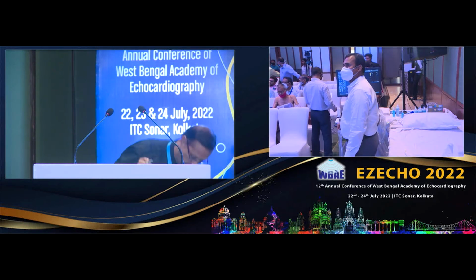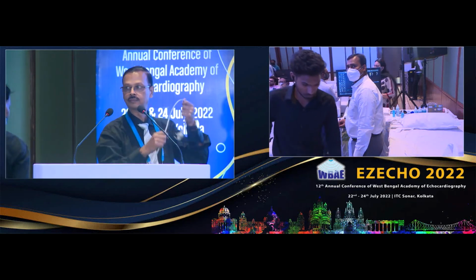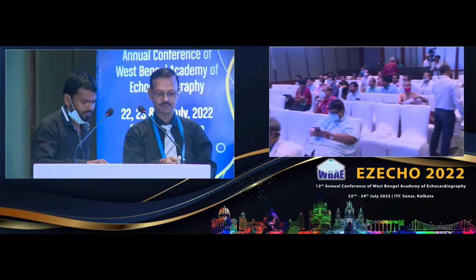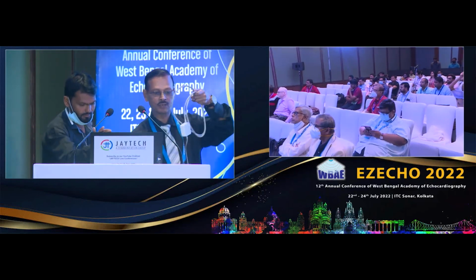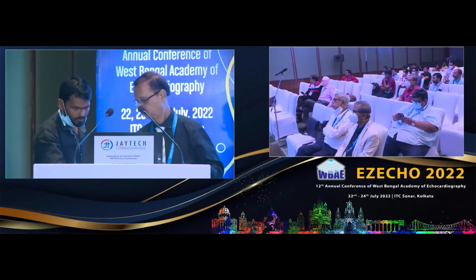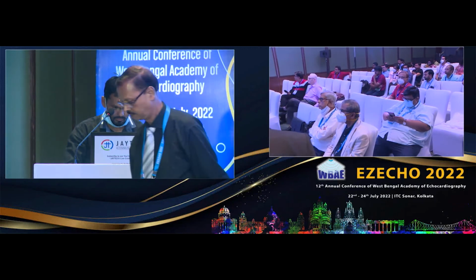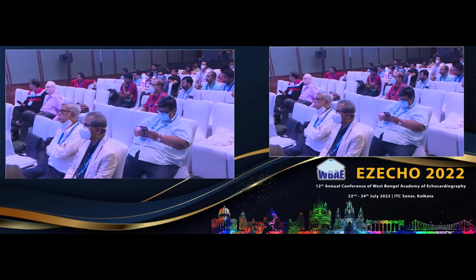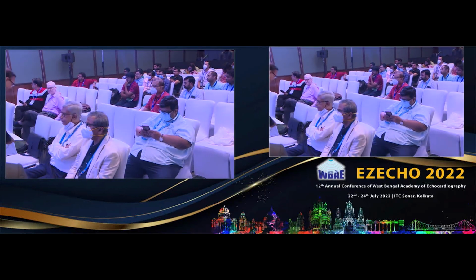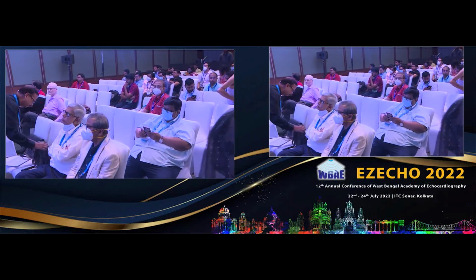First of all, you should know that patient. You can't just work like a technician, that is most important. Try to find an explanation for each finding, and then suddenly you get a tremendous insight into the management of that patient. So look at the 2D very thoroughly and try to explain everything, and then you will land up with your answers. Don't blindly take three views, then take the flows and everything. Don't do it that way.